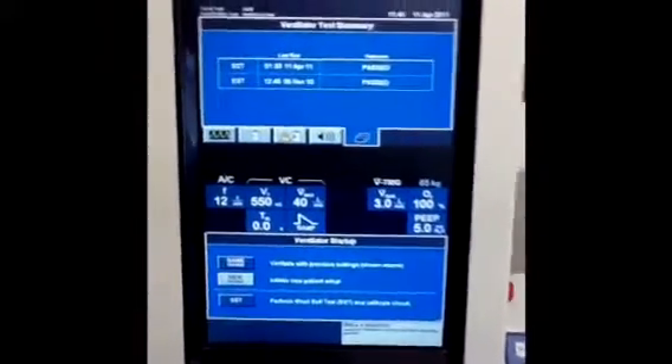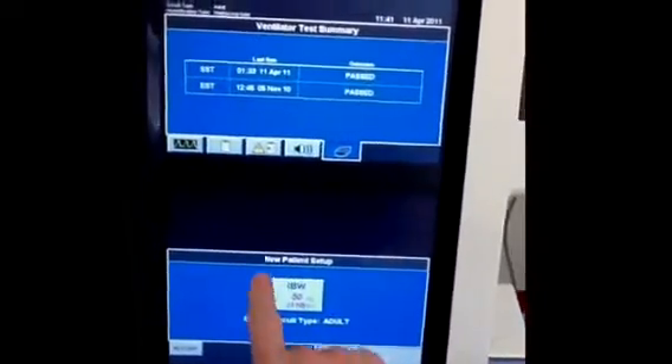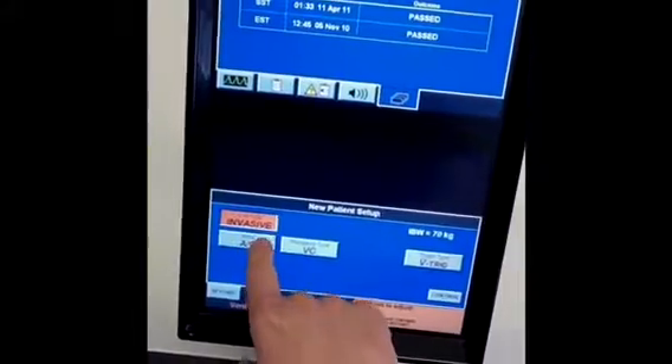For a new setup on the PB840, we assume that the SST has already been completed. Go ahead and select new patient, then select the ideal body weight for that patient using the selector knob. Once we select our body weight of 70 kilograms, hit continue. You go into the new patient setup. We'll select invasive mode because this is an intubated patient. You can select between assist control, spontaneous, bilevel, and SIMV.